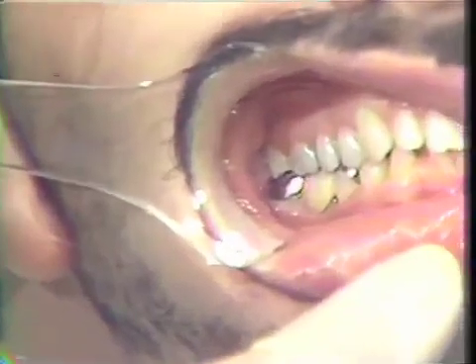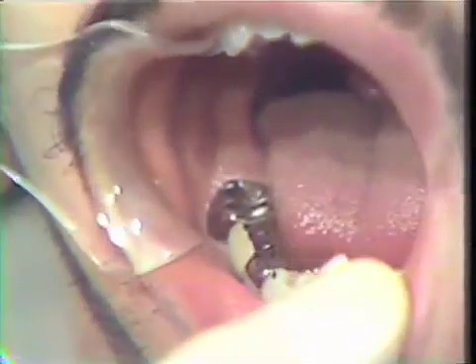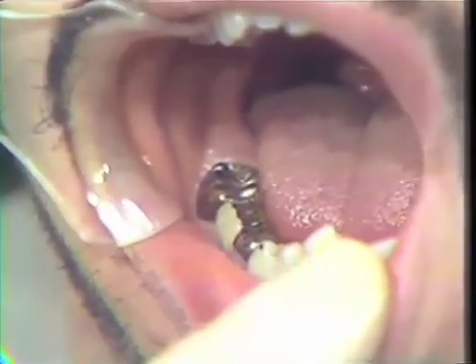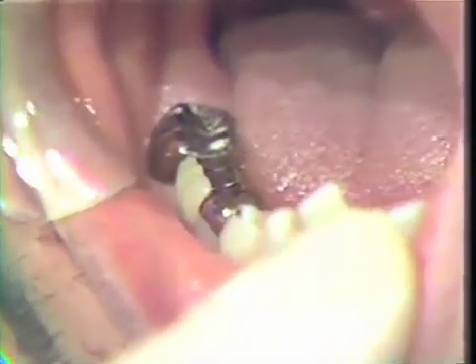And you can see that we do have a rather aesthetic result. And open again, please. And turn your head towards me a bit. Fine. And we have generated the type of occlusal anatomy which would be acceptable in any particular circumstance.